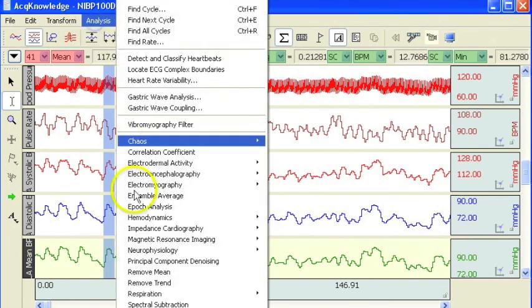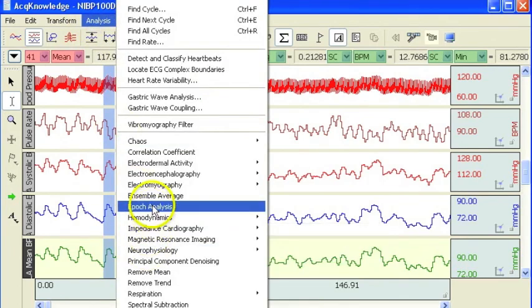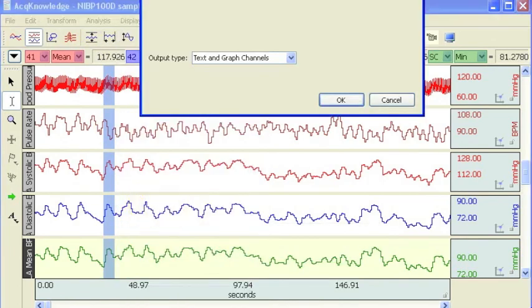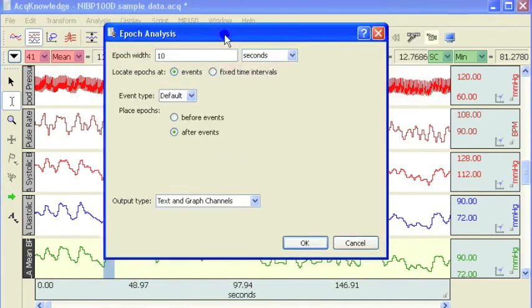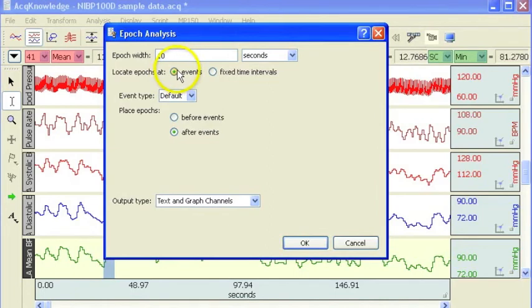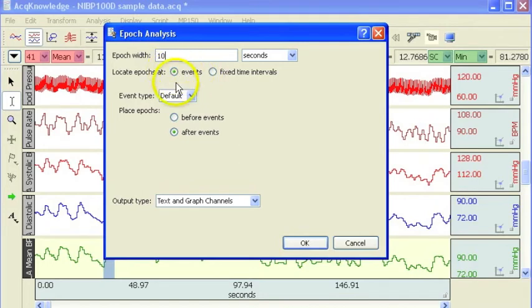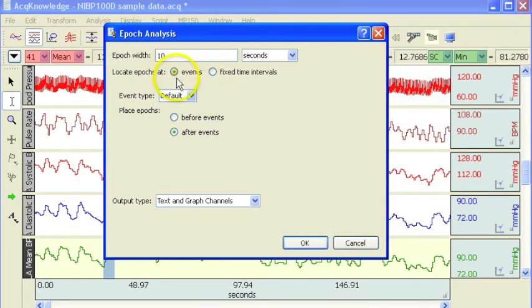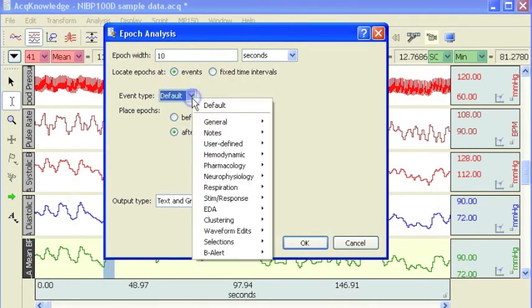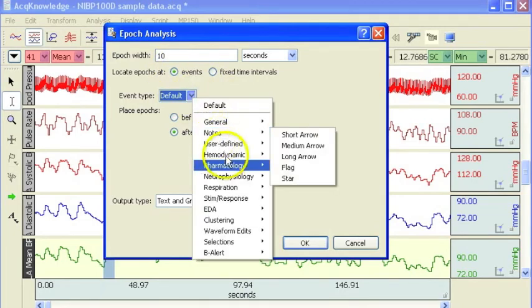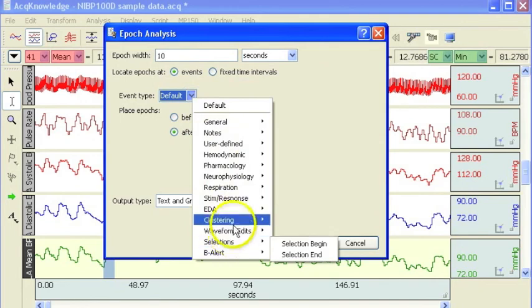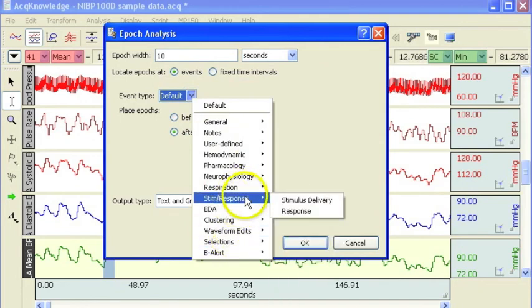If we come back into the setup, there is also an option here to trigger the measurements from events in the recording. So these events could be digital marks that are coming from Superlab or E-Prime, in which case you need to look up the type of event. So if it was a stimulus, it goes in there.